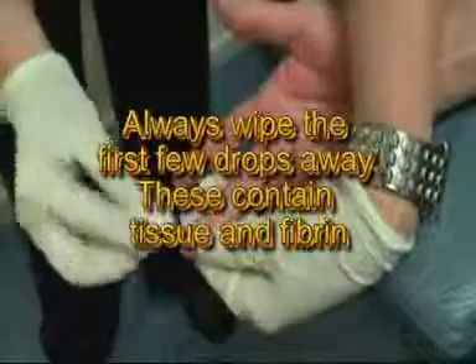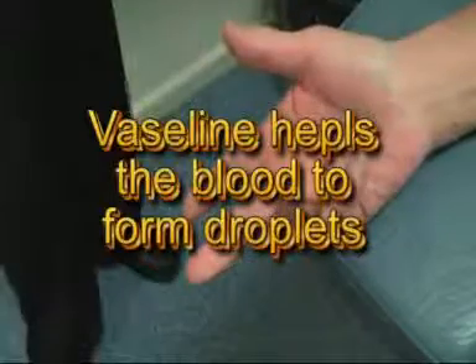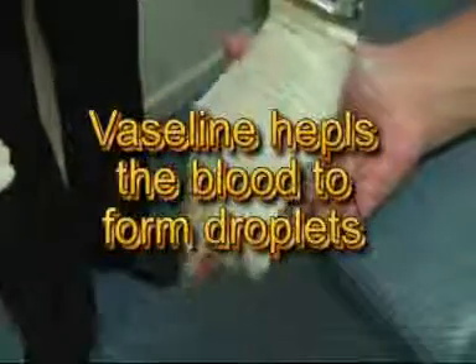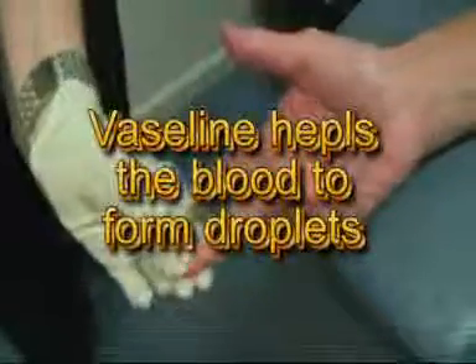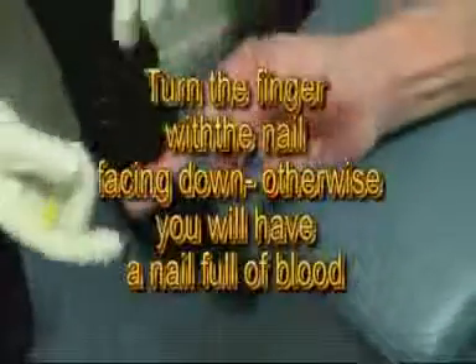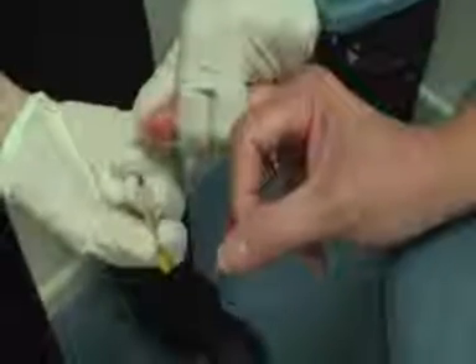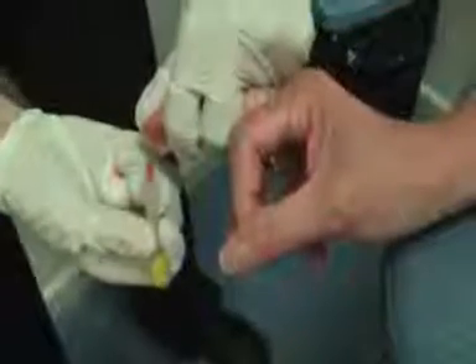Wipe the first few drops away and then apply a thin smear of Vaseline. Apply pressure behind the patient's finger and then in a milking action squeeze towards the top of the finger. Let the capillary fill and squeeze again.